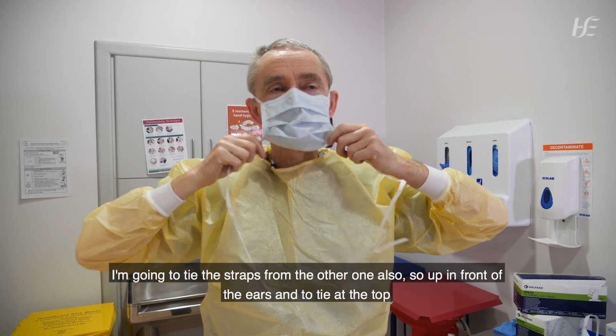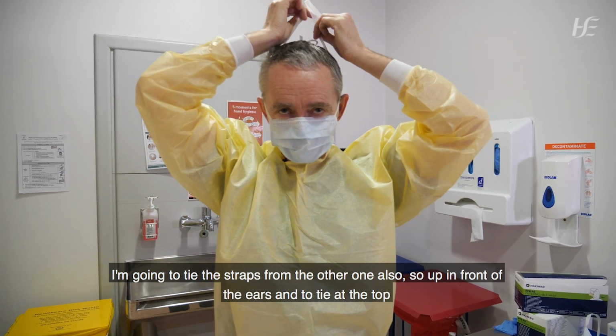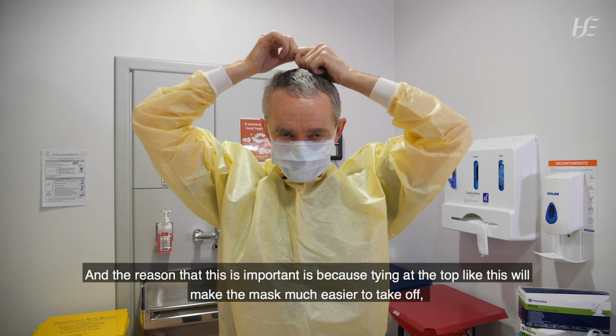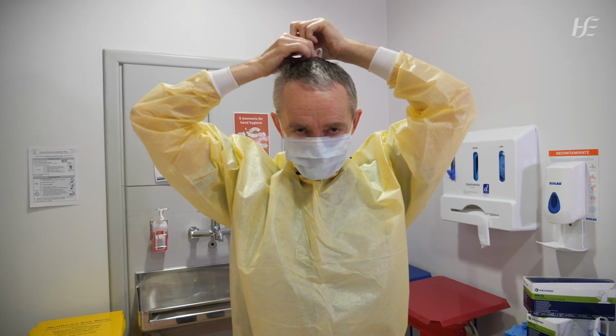I'm going to tie the straps from the other one also, so up in front of the ears and to tie at the top. And the reason that this is important is because tying at the top like this will make the mask much easier to take off when we get to the stage that we want to remove the mask.